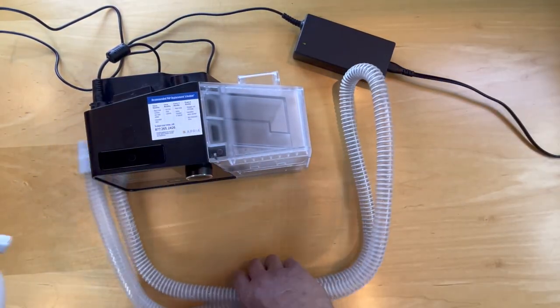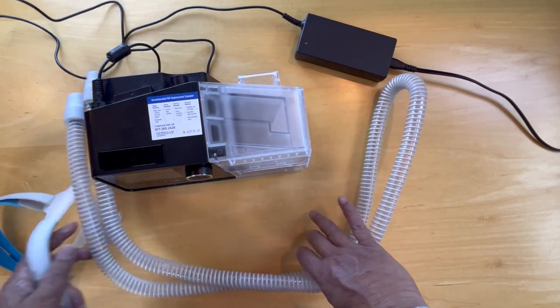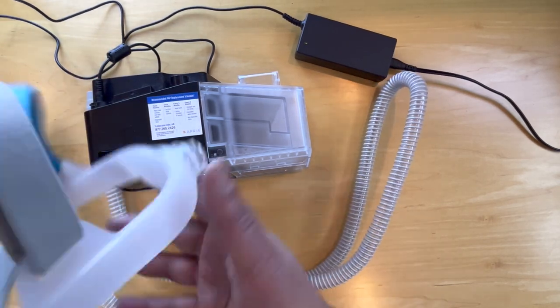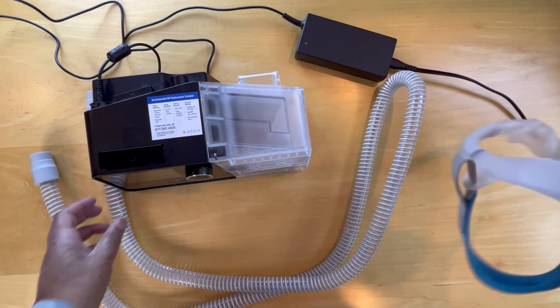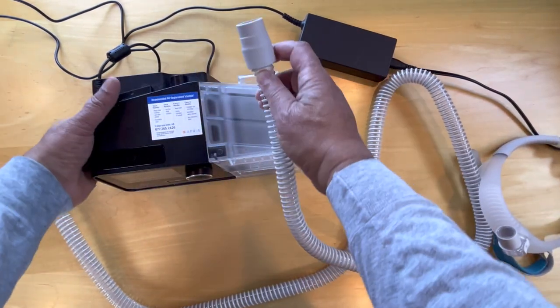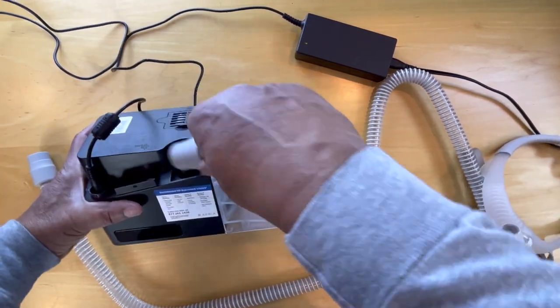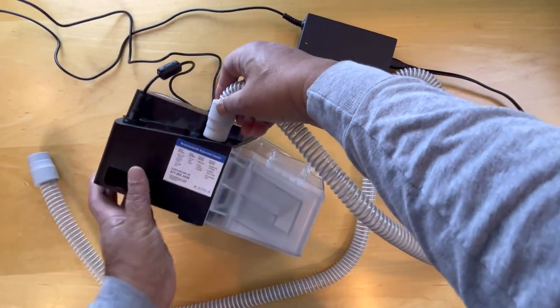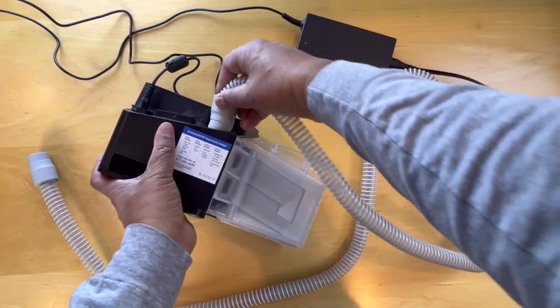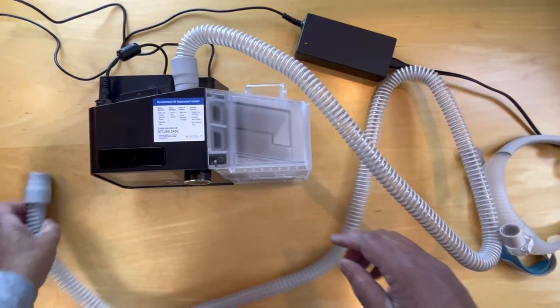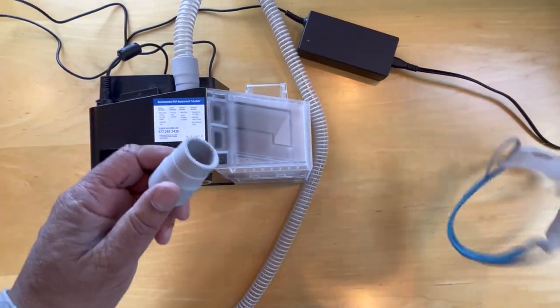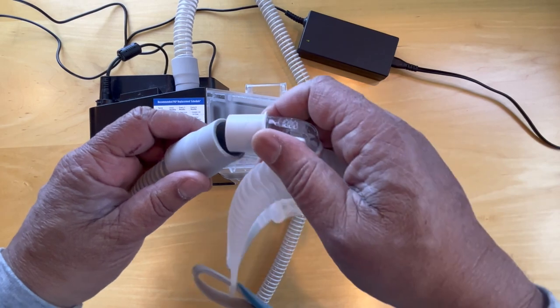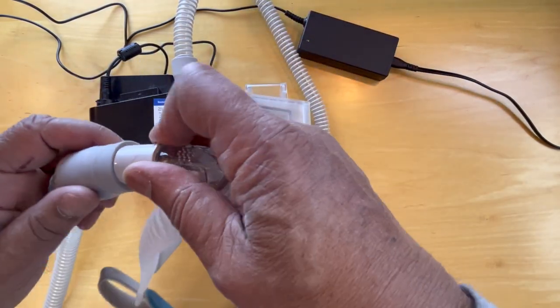Here we are with the hose pack and the AirFit face mask. So we take this one end of the hose and we plug it in here. And the other end goes to the face mask.